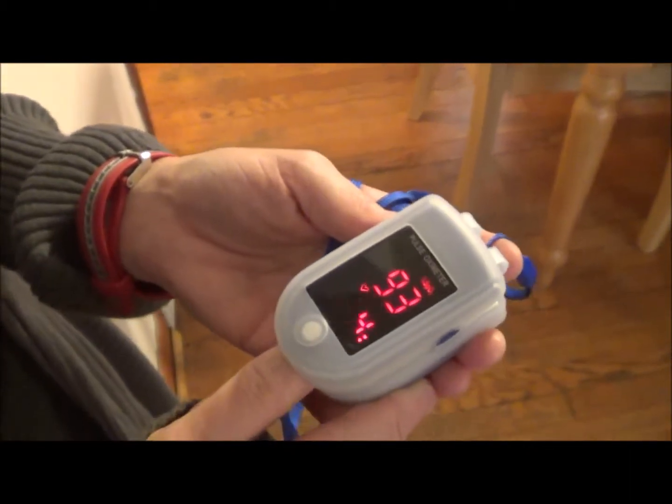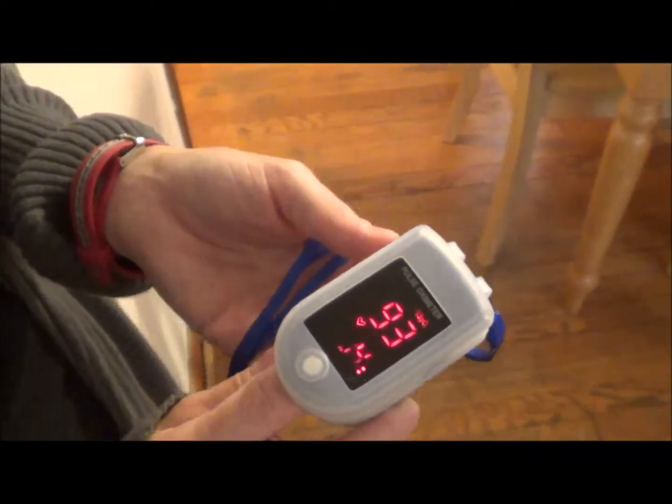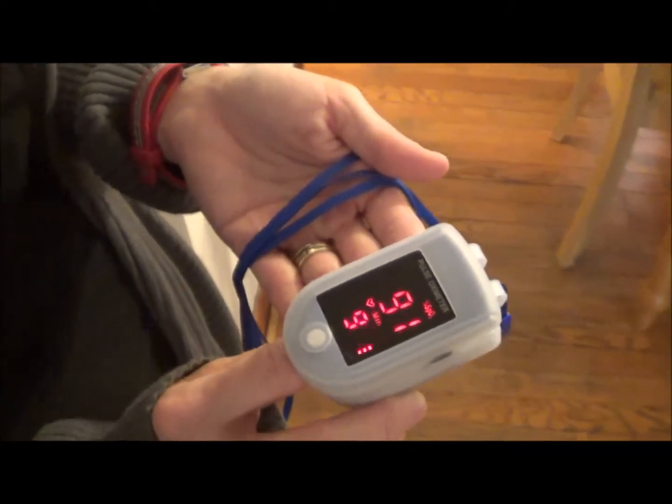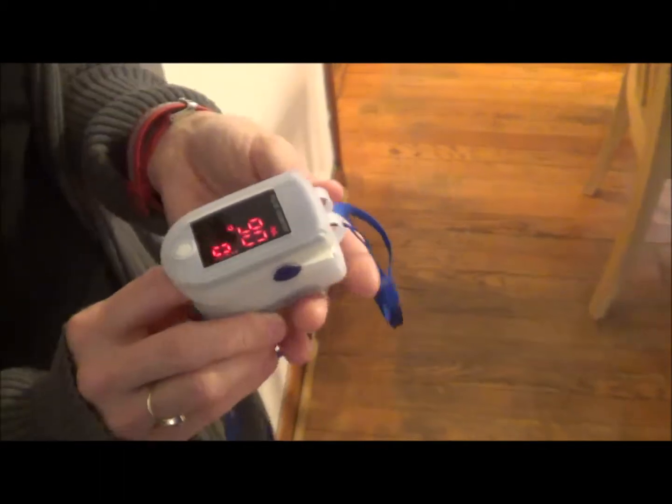This is recommended for ages 15 to 60. I did try it on my younger children and it really did not give a good reading because their fingers are too small. But on adults this works great.